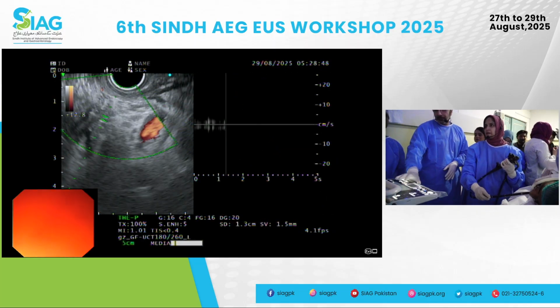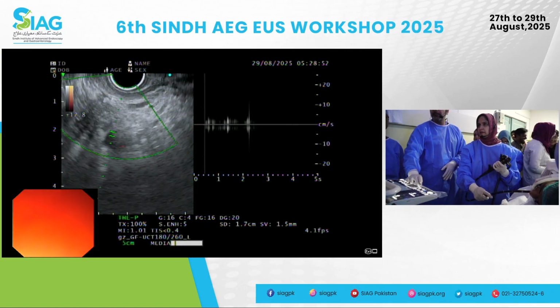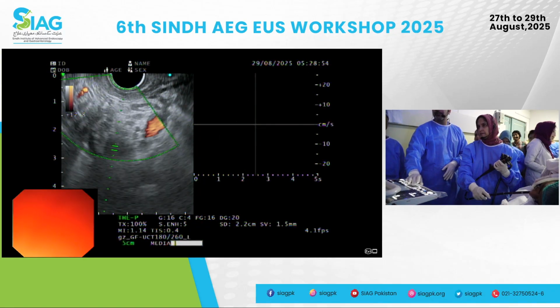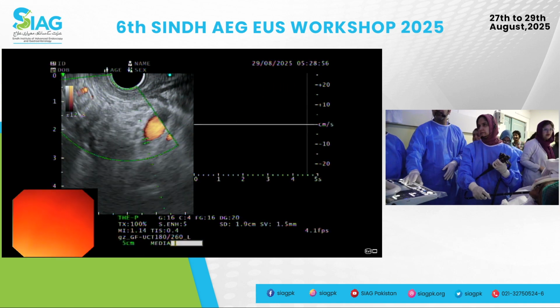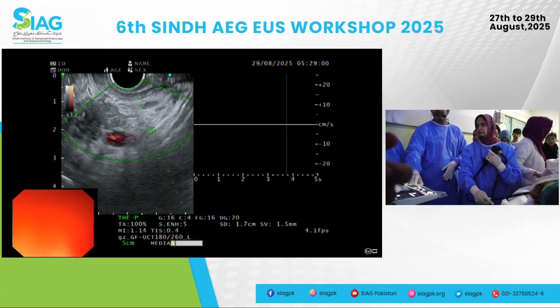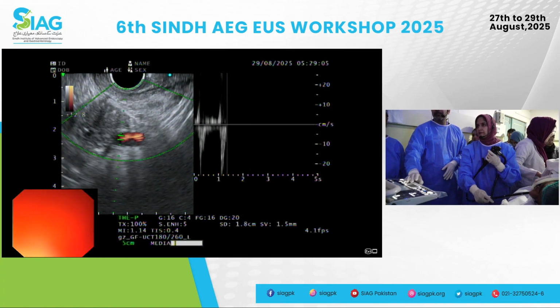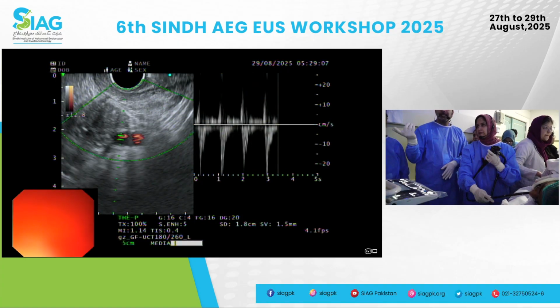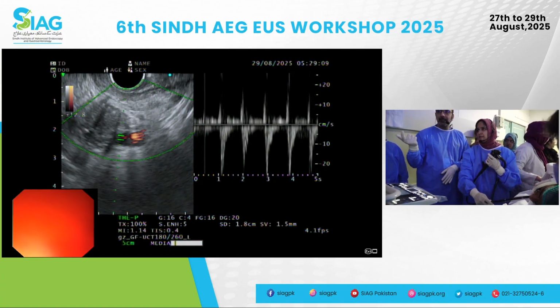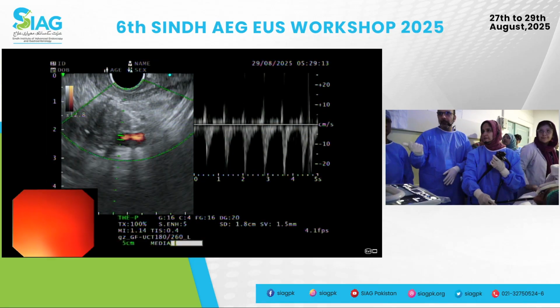What you can do is, if you suspect a vessel to be a varix, you could put this on and see. So it's a moving target. Try not to move the scope, because if you move it, then I can't measure it, right? I'll stay here. So what is this? Arterial most likely. Which artery? Splenic. Good. Keep going clockwise for a sec.